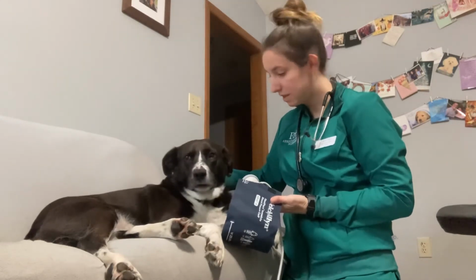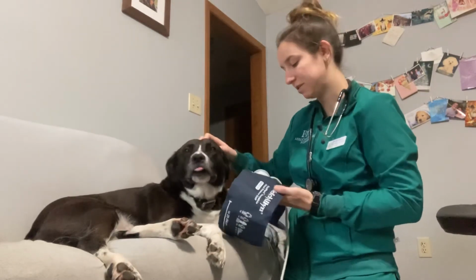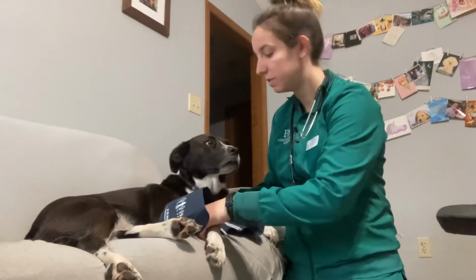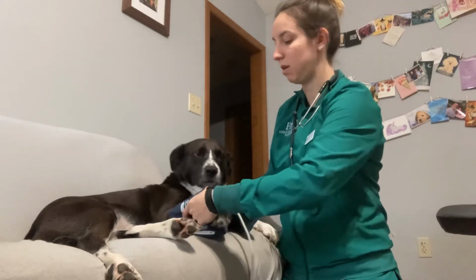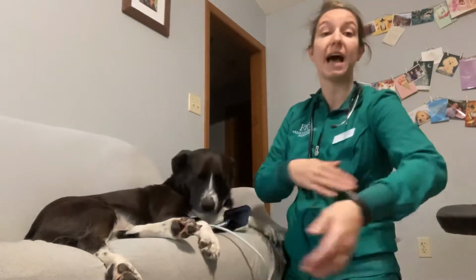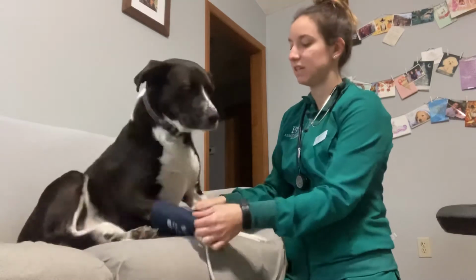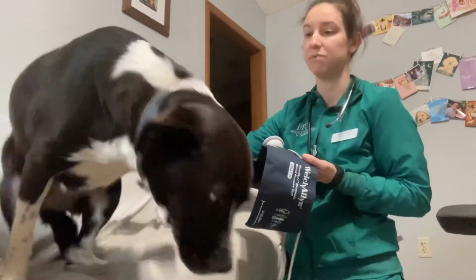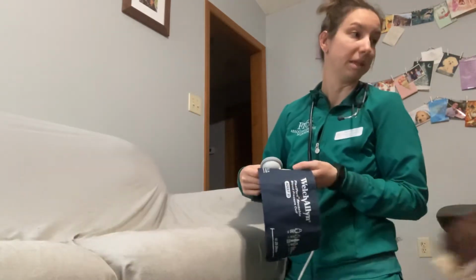Okay, baby girl. Is it okay if I take your blood pressure? Oh, are you bored of this? That's okay. So for my Sadie, I can try to apply this to an upper arm. In an adult, this would be going around the bicep area, the upper arm. Ideally keeping it up fairly close to the pit, the armpit, the axilla, because up here it's a little bit easier to find that good strong pulse. Now, Sadie is not a big fan of this guy, and that's okay. I'm not here to scare her or freak her out, and she's just straight up gonna leave me. But all the dogs are gonna leave me, that's fine.